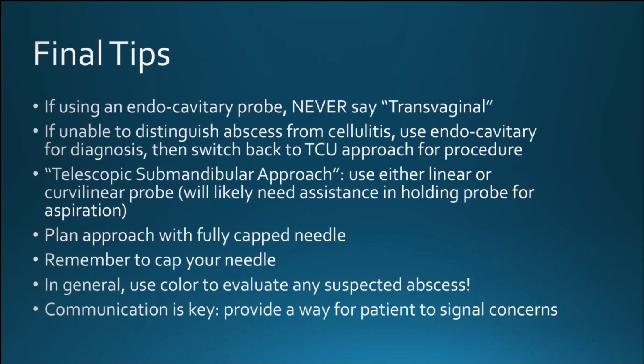And then communication is key in these type of things, especially in the mouth, where the patient isn't going to be able to voice any concerns. So when the patient's mouth is open in these cases, if they need to signal you or say something, or they get secretions in their mouth, you can give them a suction to use as needed. You can also have them use that suction and raise it up as a signal, instead of trying to talk or move while you're trying to insert a needle. And that's just some safety things to be aware of and keep in mind when you're doing these type of procedures.